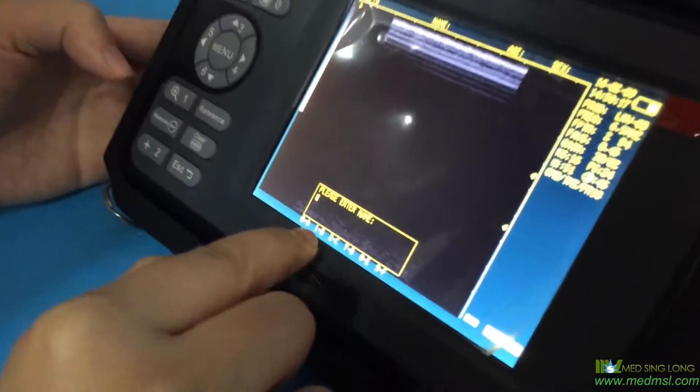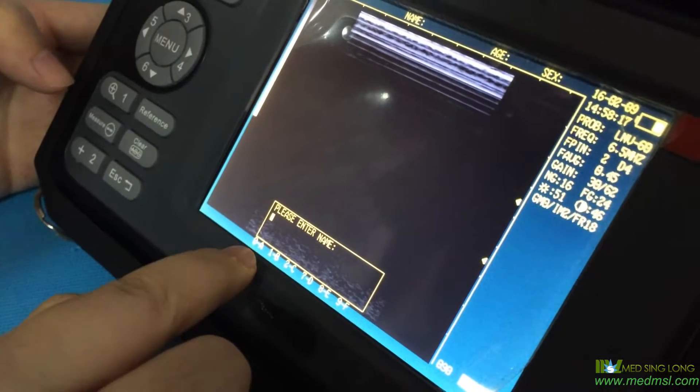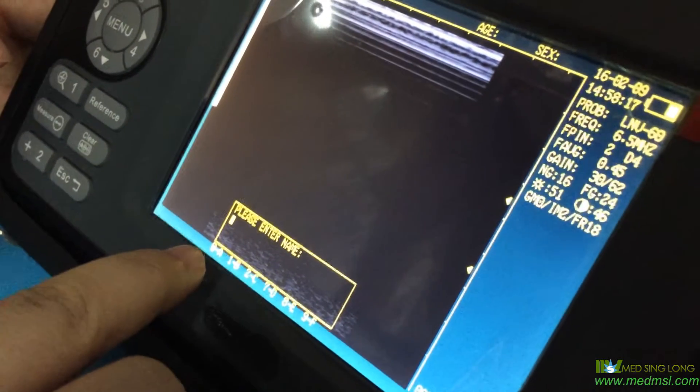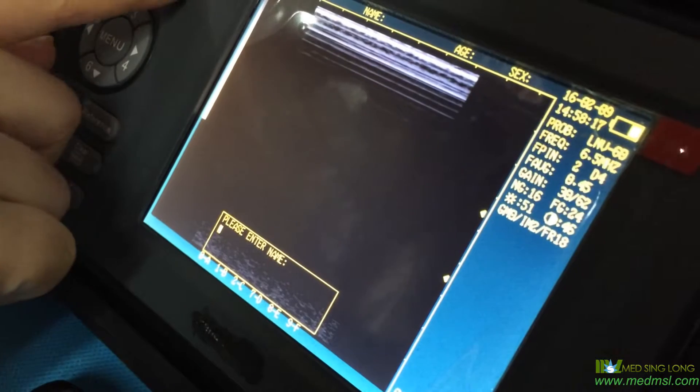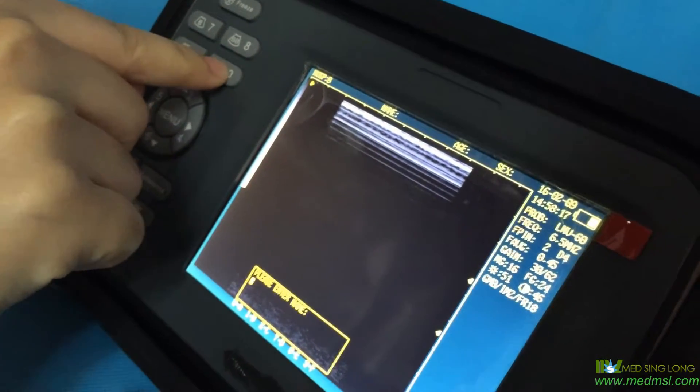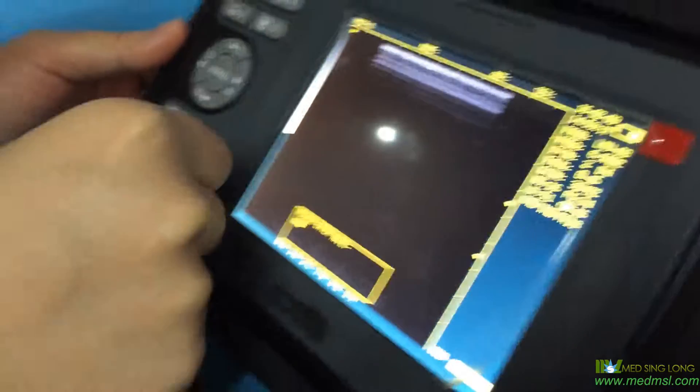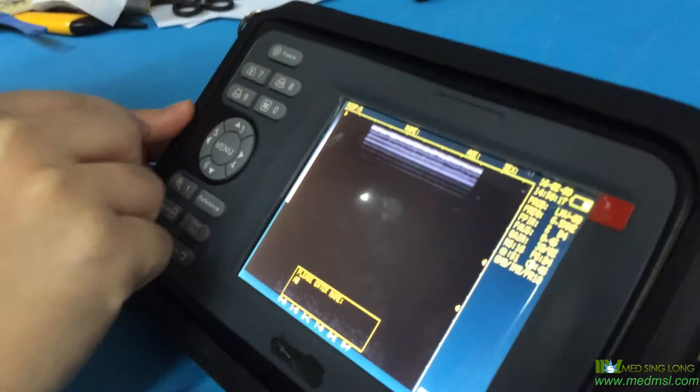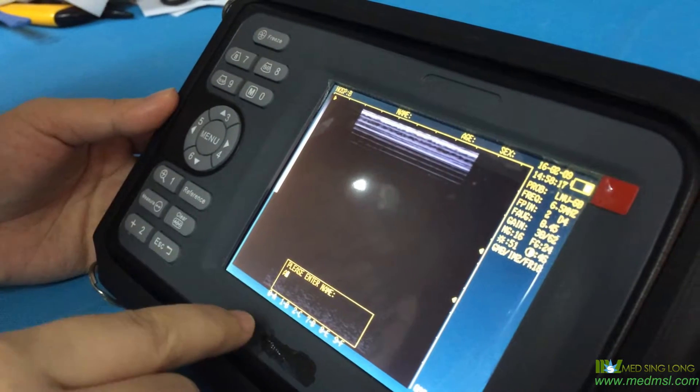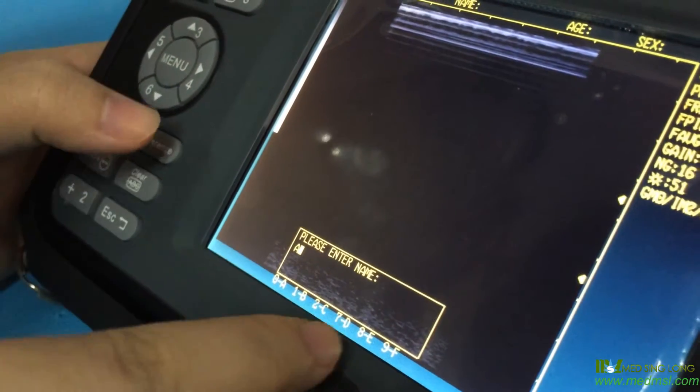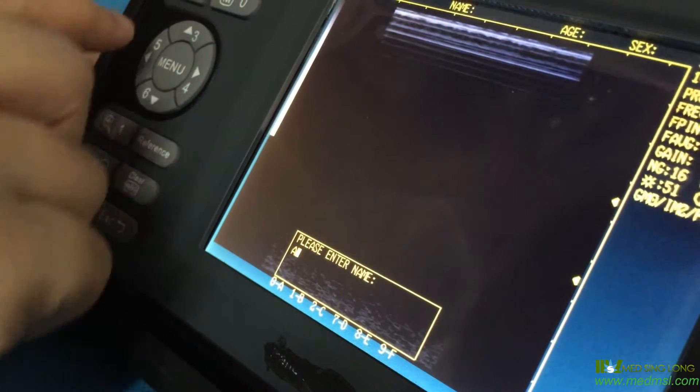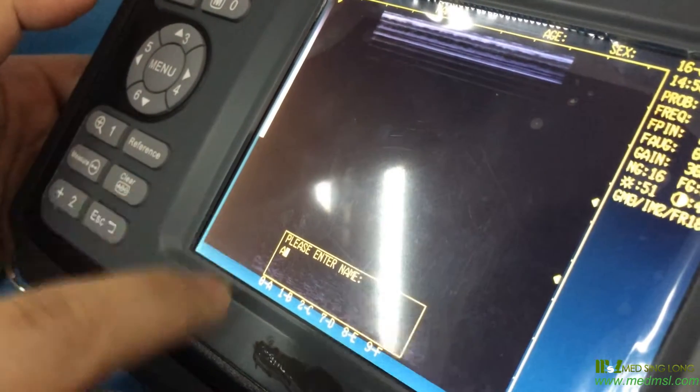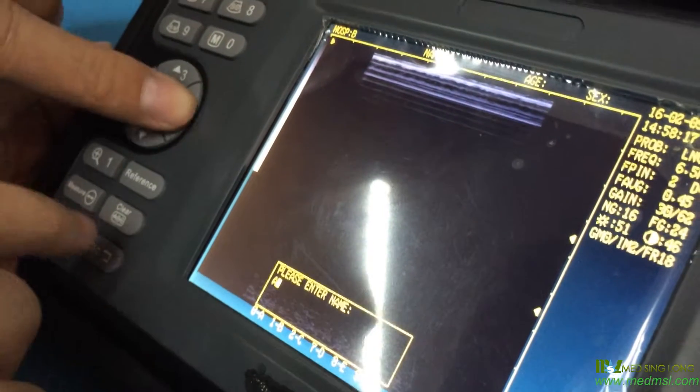So to write the name, you push the zero button. Now it's A, and you continue pressing to get M. If you like, AA can be the name, or you can continue entering letters as needed.